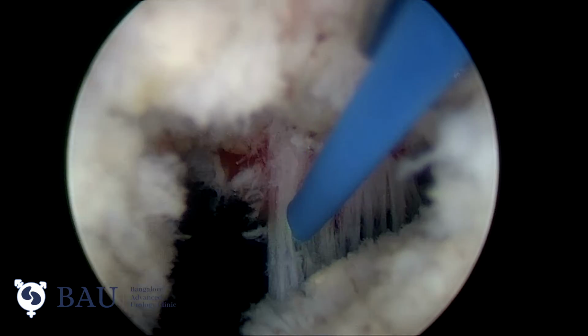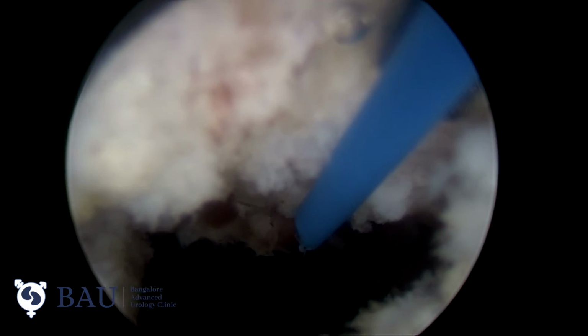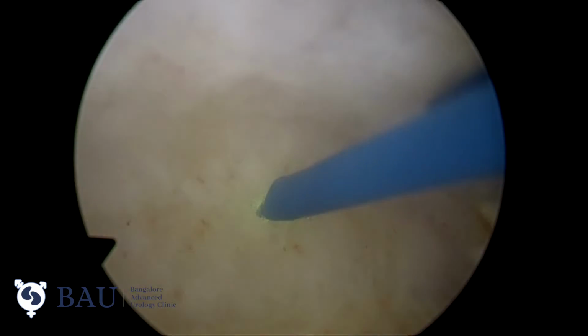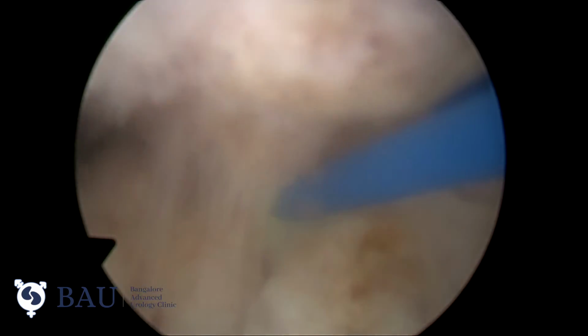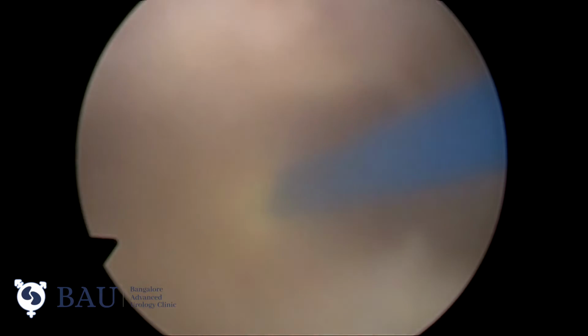These mucosal bleeders are the major concern during morcellation. Better to tackle these bleeders during dissection of the bladder neck itself. You can see continuous oozing from the mucosal bleeders.